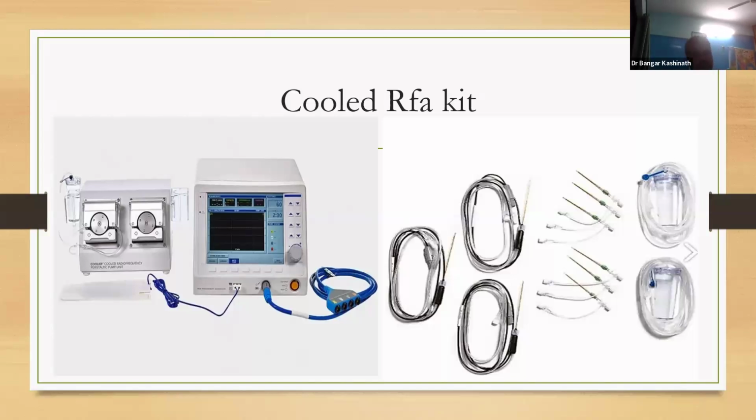So what different questions will there be? The difference between cooled radiofrequency, bipolar radiofrequency, and conventional radiofrequency ablation. These three are ablation: cooled, bipolar, and conventional radiofrequency ablation. Pulse is a radiofrequency where we do not ablate the nerve because it is at 42 degrees. Here the question will come: how is the lesion size bigger? So what will be the difference between cooled radiofrequency and the conventional?